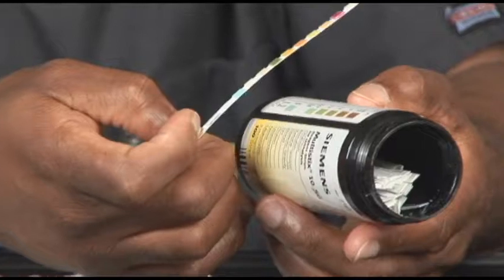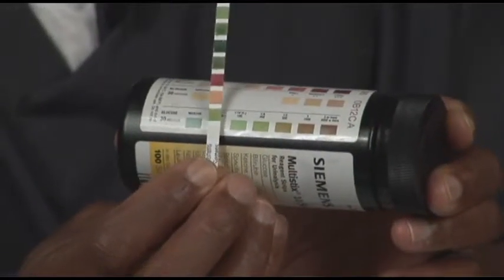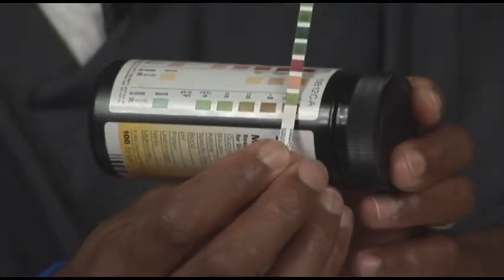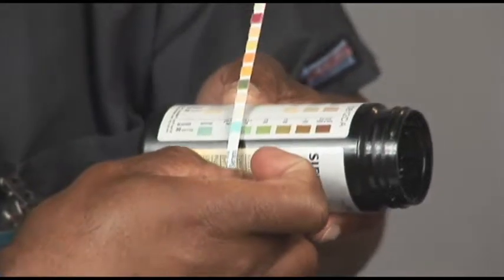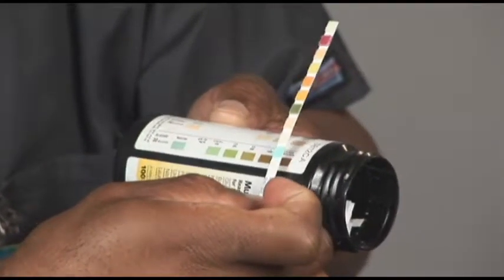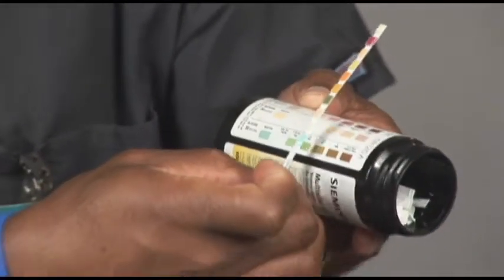I usually start at the bottom with glucose, and normally you would wait 30 seconds and you read across from left to right. So glucose, you wait 30 seconds and you scan across, and whatever color change is, it has a corresponding number to it. That is what you would record.